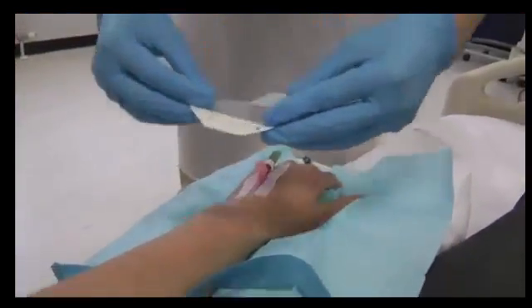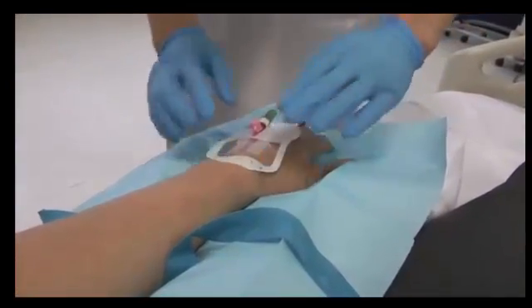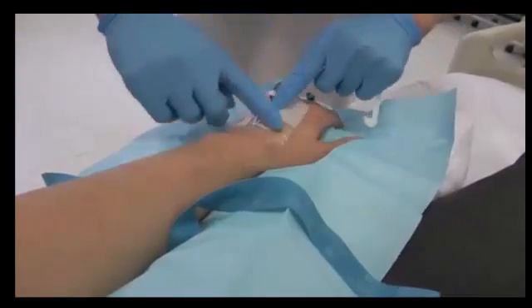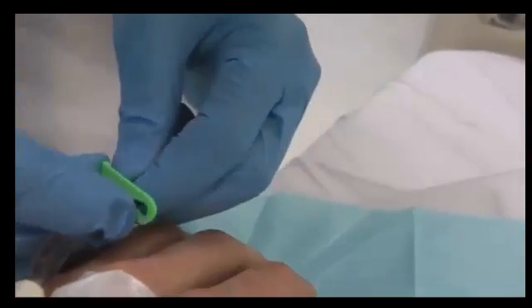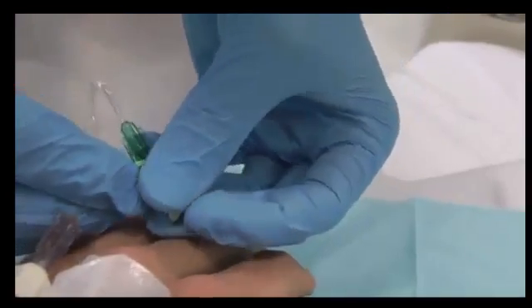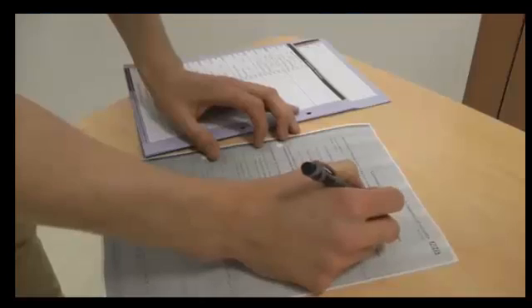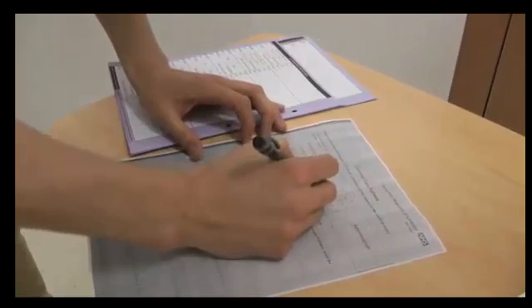Place the rest of the dressing over the cannula, making sure the entry site is visible through the clear window. Don't forget to add your dated label at the side of the dressing. Finally, clip the end of the bionectar so that it is neat and secure. Wash your hands and thank the patient, making sure the flush is prescribed and the procedure is documented in the patient's notes.